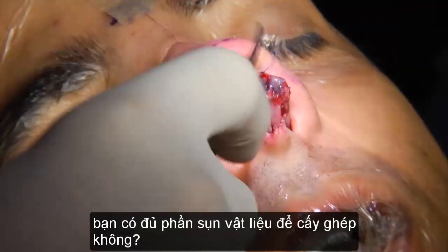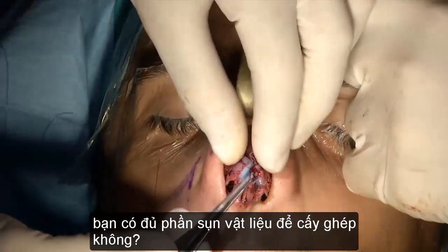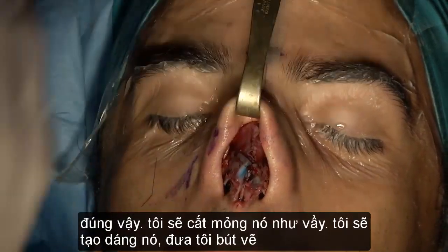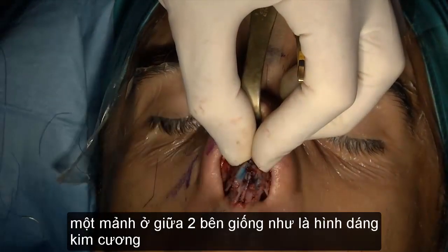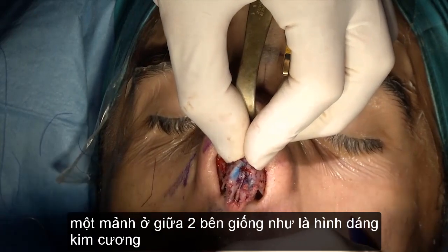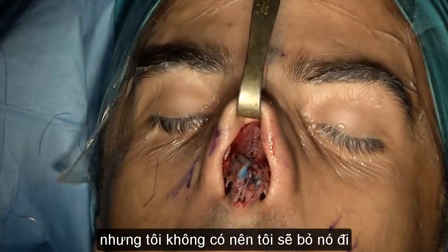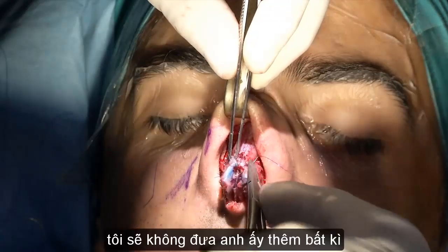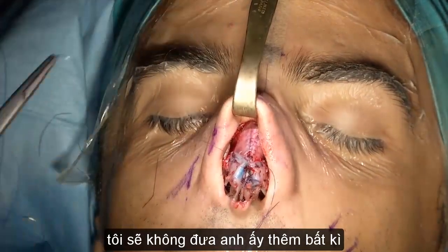Had you had more cartilage material, what other grafting would you be doing? I would have made a thin sliver like this. I would have shaped a thin sliver just to go between the sides of my diamond. But I don't have it, which I'm kind of pissed off about because I should really want it. I really don't want to give him any further donor sites for this.